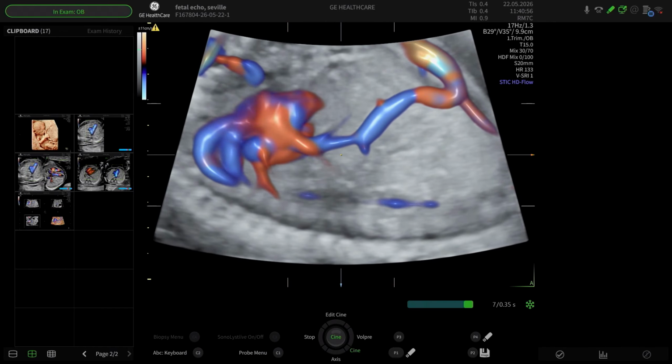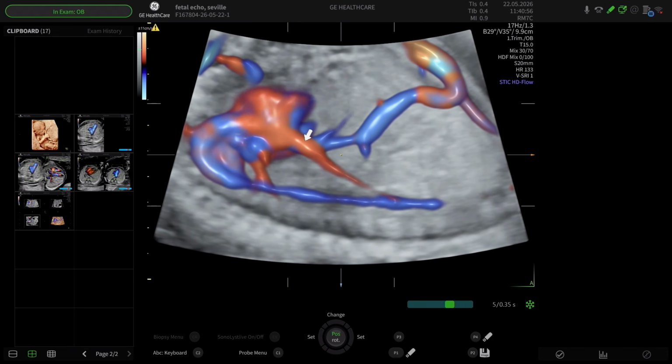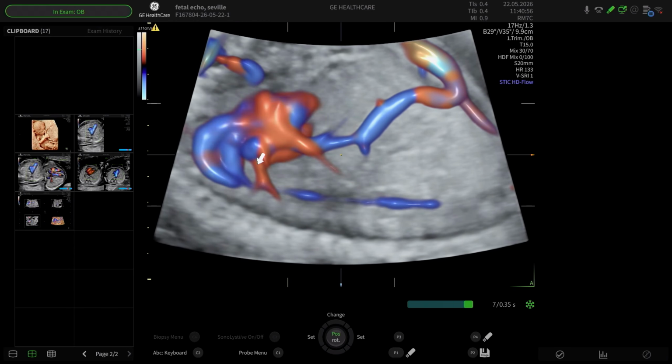I don't have to do a rendered image. It allows me to see the course of the intrahepatic vein. There's no umbilical vein varix. It tracks normally, feeds into the portal sinus, into the left and right portal vein, continues superiorly as the ductus venosus, joins the left hepatic vein and the IVC, forms the infradiaphragmatic vestibulum, and enters into the right atrium. You have the aortic arch giving off the neck branches and the ductal arch here. You have the pulmonary veins. Right and left pulmonary vein on one side entering in, and then you have your descending aorta. It's just so quick to do that.